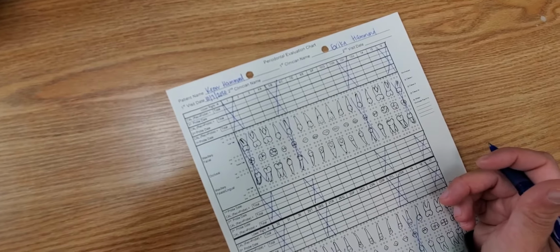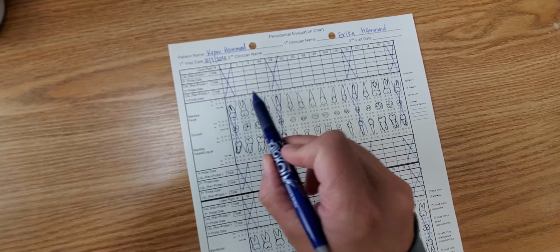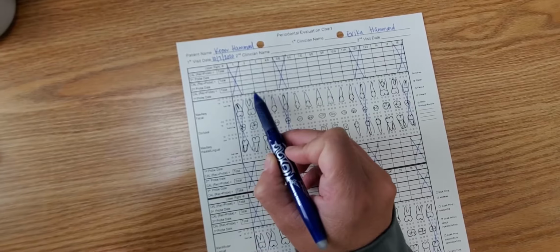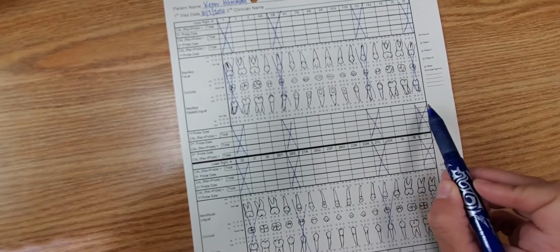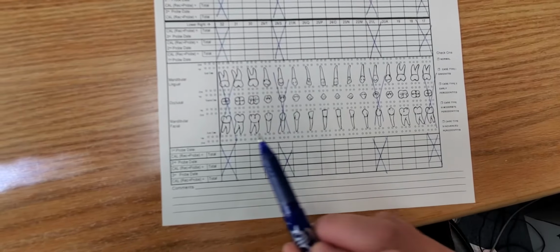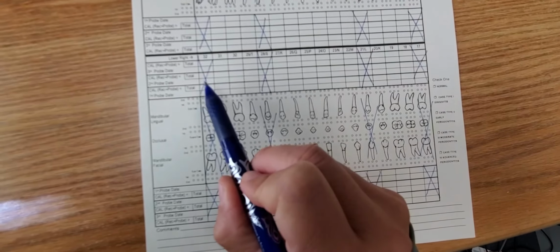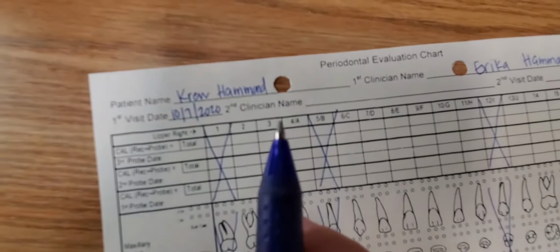begin. In our sequence, we follow 1 through 16 buccal, so you'll write left to right with the numbers. Then we go 1 to 16 lingual. Watching carefully on the bottom, we then go 17 to 32 buccal and 17 to 32 lingual. Now there's a lot of boxes here, so let's look at what they are.